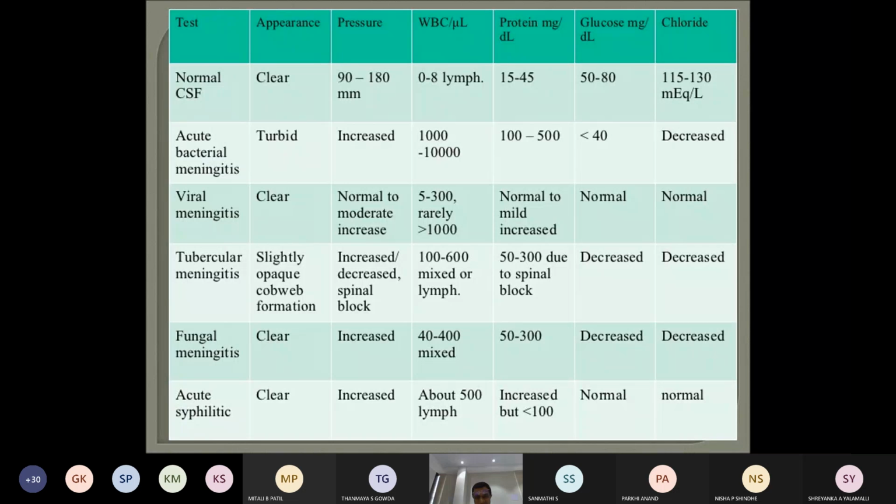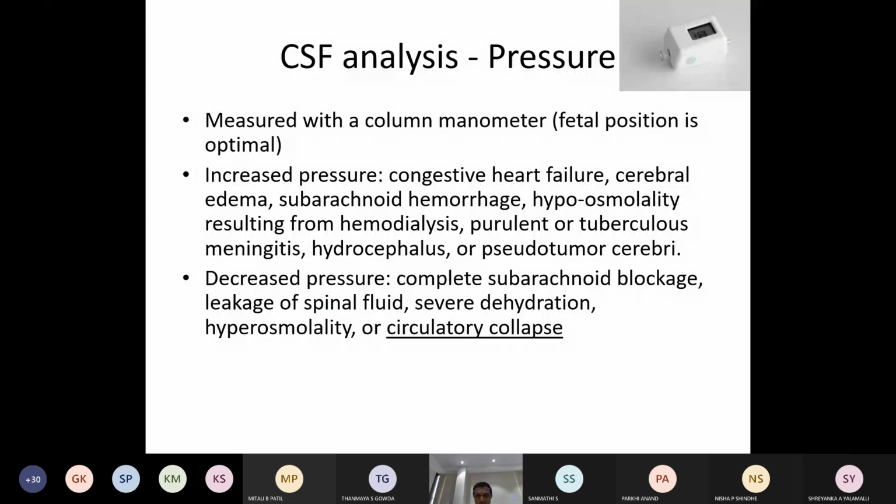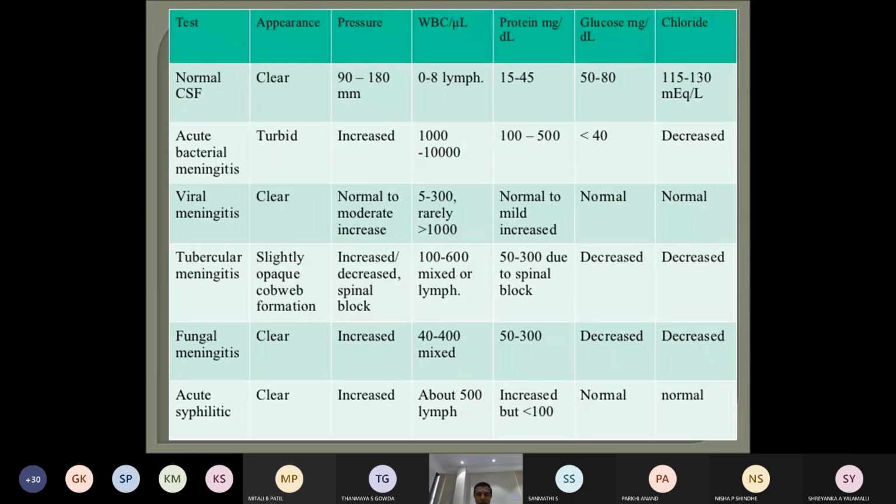So this completes it; there are other aspects too, such as hematological, microbiological, and histopathological, which help in diagnosis. This is our interpretation of what we do in the laboratory with CSF analysis: chemical composition, the principles of protein and glucose analysis, and when they increase or decrease.